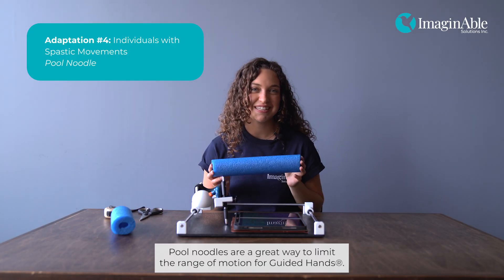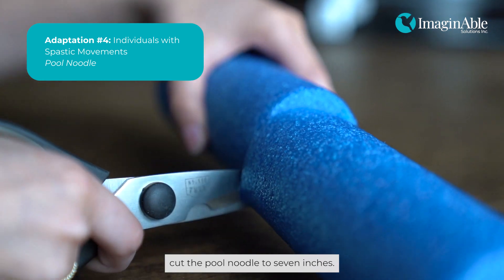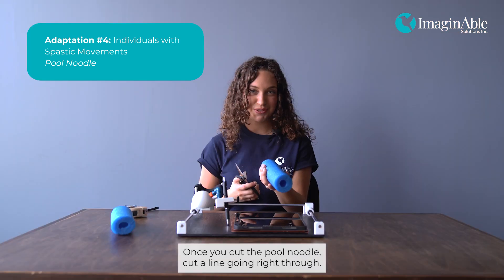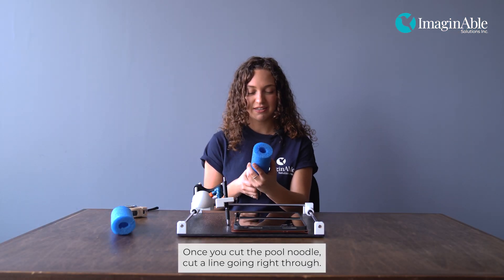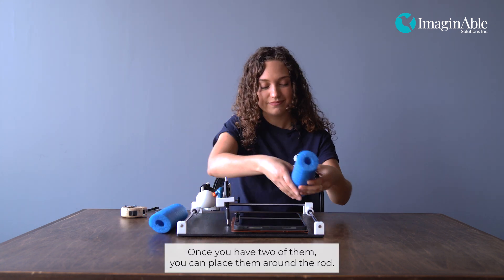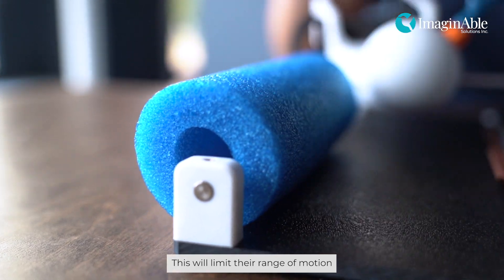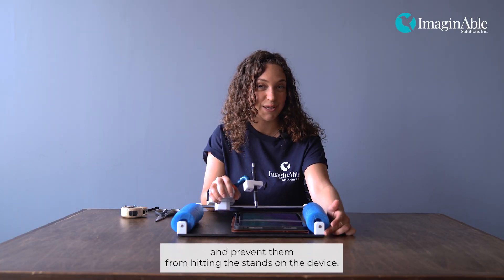Pool noodles are a great way to limit the range of motion for Guided Hands. Using a measuring tape, cut the pool noodle to seven inches. Once you cut the pool noodle, cut a line going right through. Once you have two of them, you can place them around the rod. This will limit their range of motion and prevent them from hitting the stands on the device.